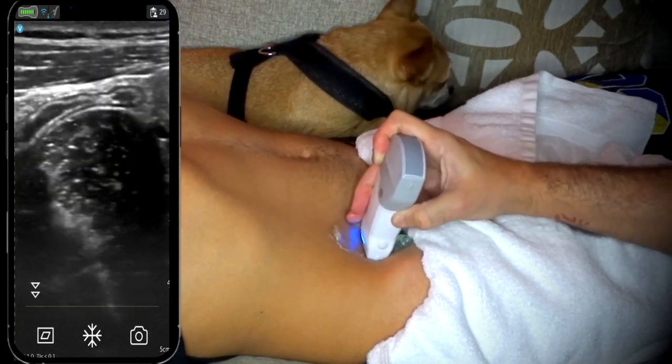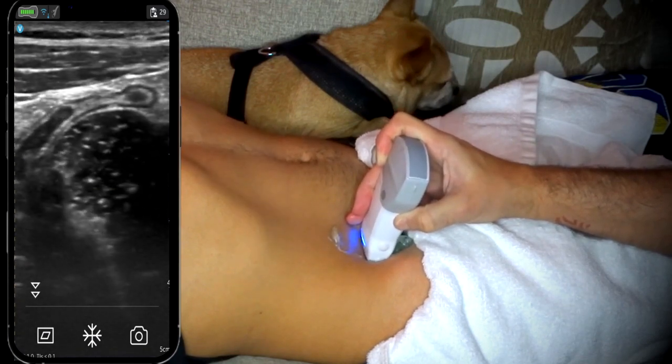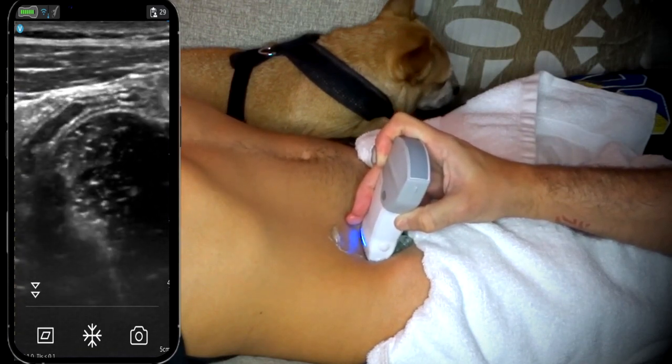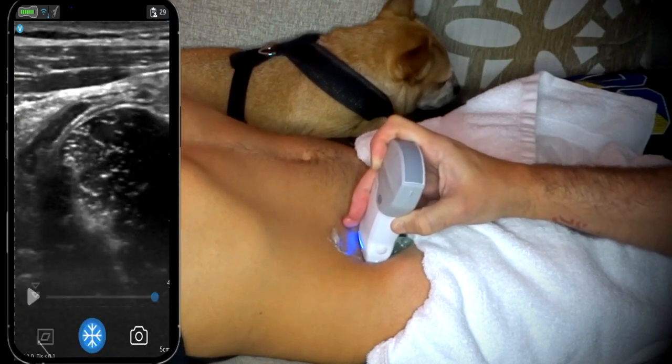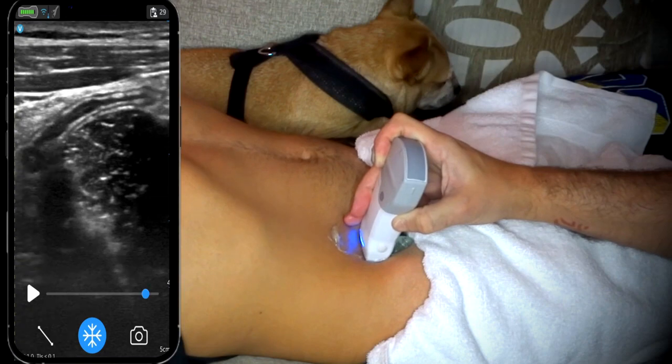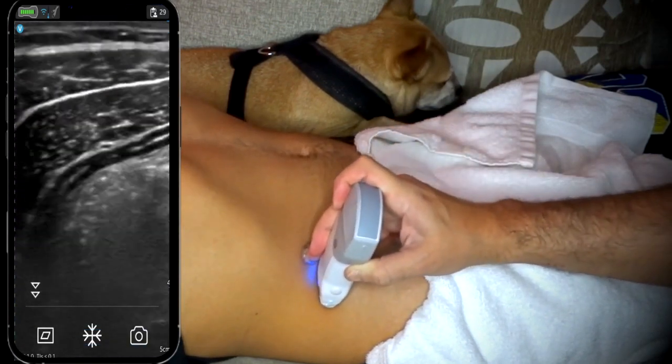So this one's draped right along the psoas muscle. All right. Very normal. Congratulations, you don't have appendicitis, bro. Take that.